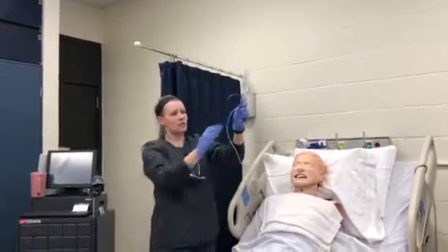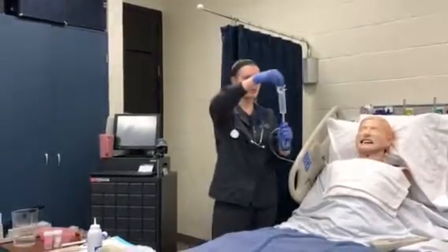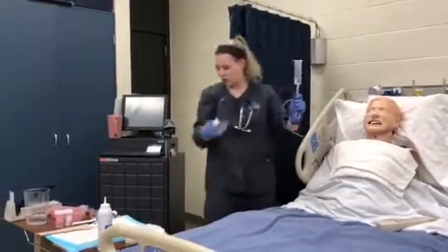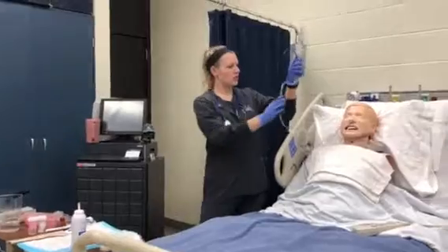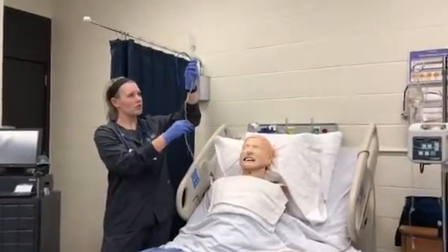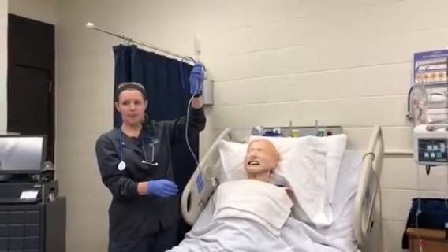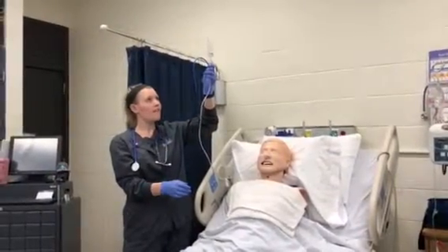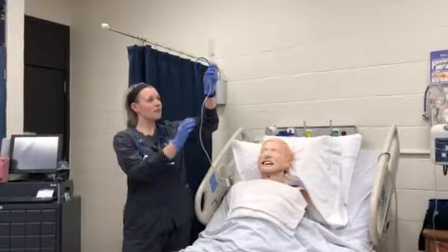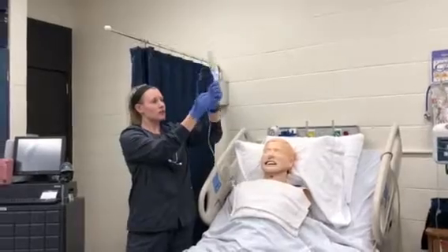Okay. Now we're going to flush again, because you flush between every single med. Let that go, it can flow through there. Clamp your tubing.